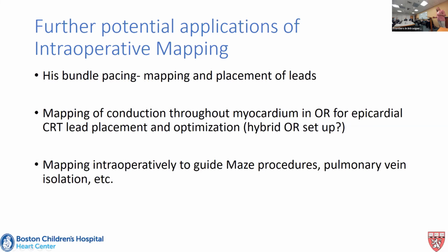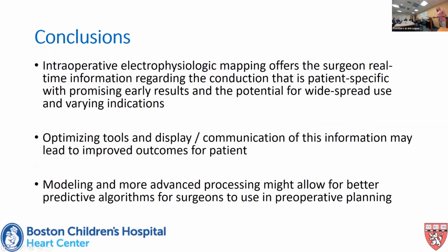And then furthermore, thinking about how we might use this technology to improve our placement of epicardial leads for either CRT or just epicardial pacemaker placement to find a spot without having to move the lead around many different locations before we find an acceptable threshold. And then finally, how could we use this and incorporate this into performing more effective maze procedures for atrial arrhythmia surgery?